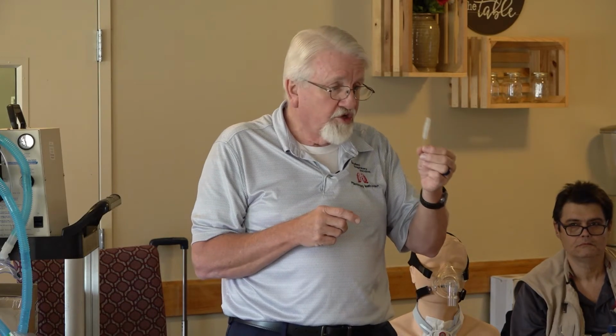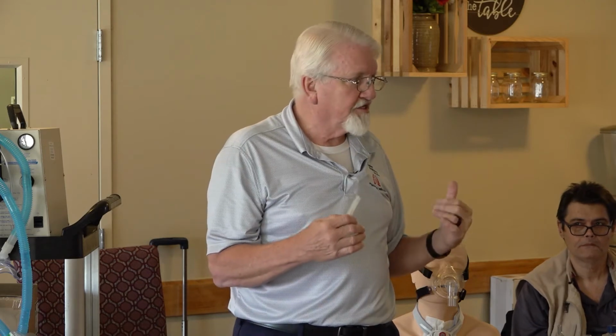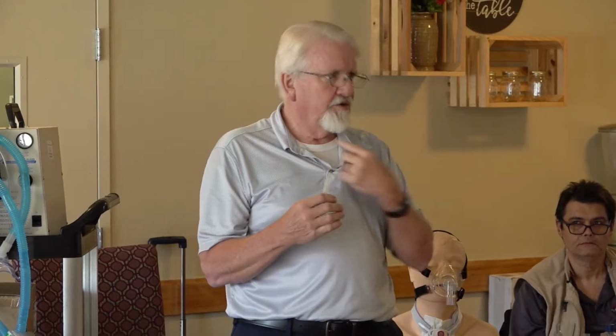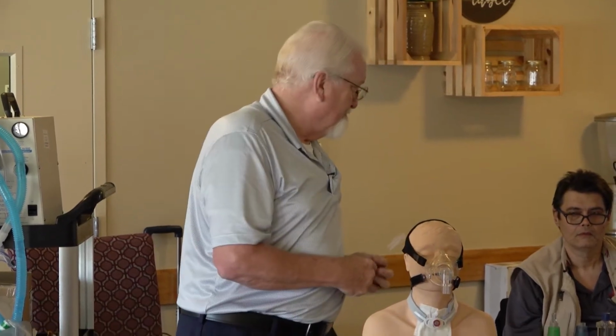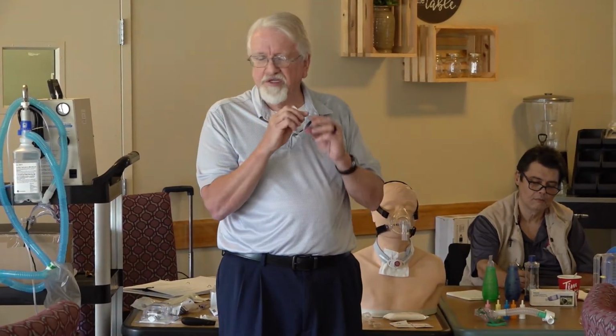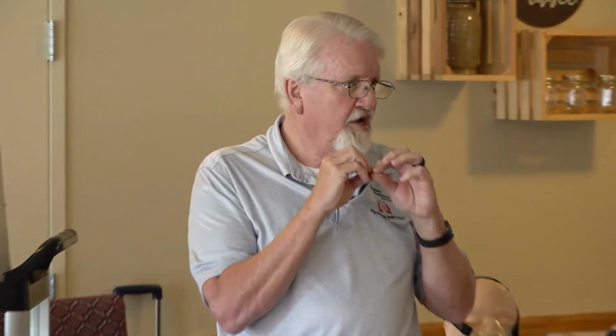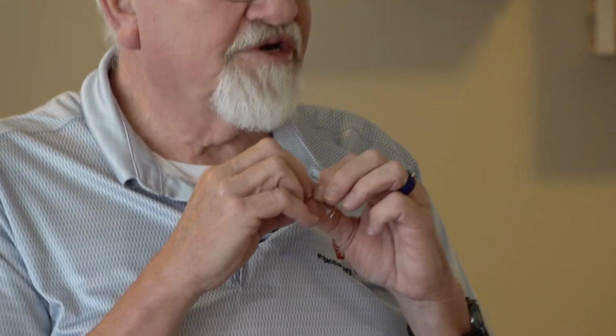So the first thing I'm going to do, and you'll actually have to look in the stoma, because standing right here like this, if I had one, you probably couldn't see it. You're going to have to look up in there, okay? Kind of at an angle. You're going to take your brush, sterile water, you're going to insert your brush, and then gently you're going to go back and forth a little bit and twist it at the same time. And you're going to do that about 3 or 4 times, okay? Don't get crazy or aggressive. Just back and forth a little bit, twist 3 or 4 times, remove, clean it. Now I'm going to take my plunger.